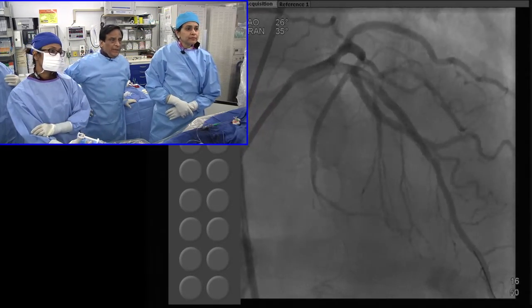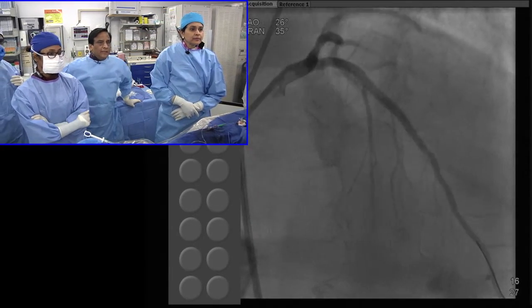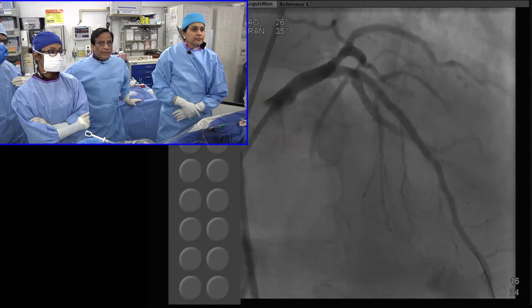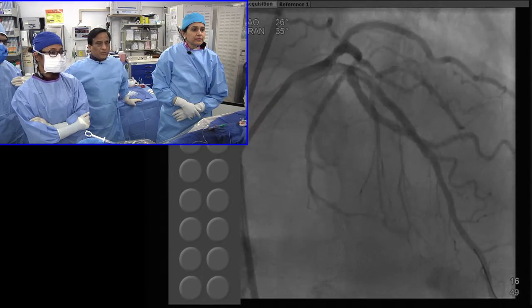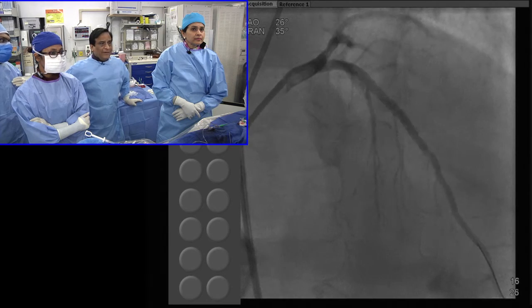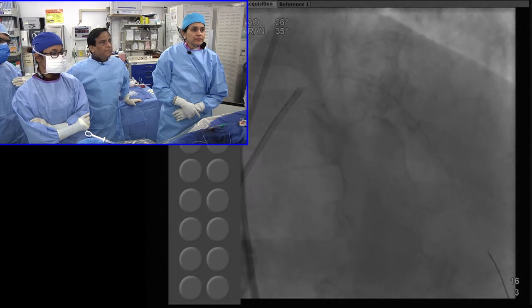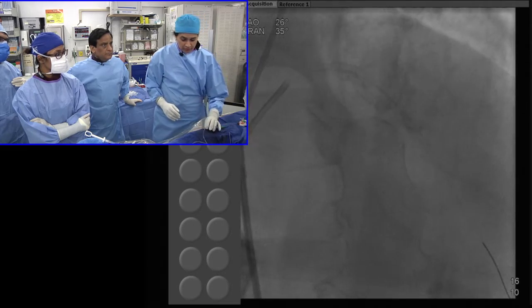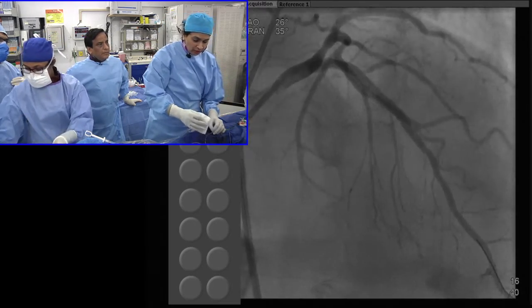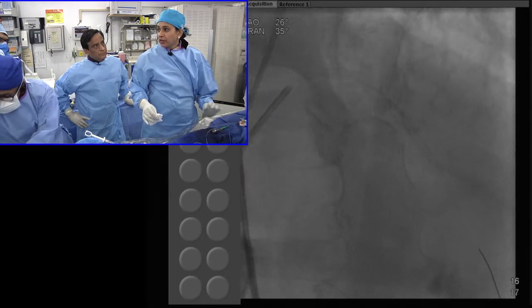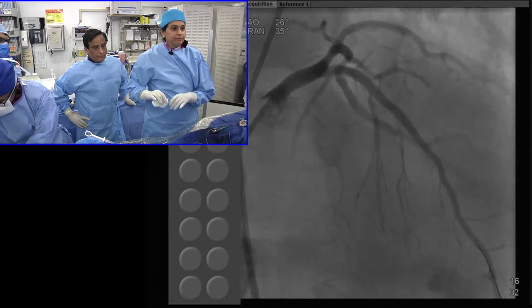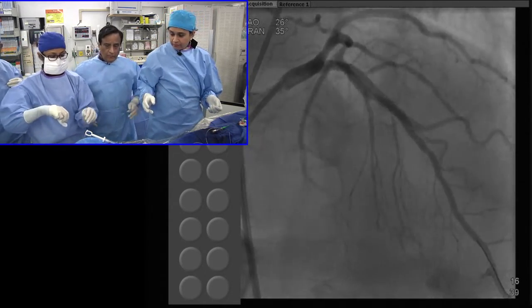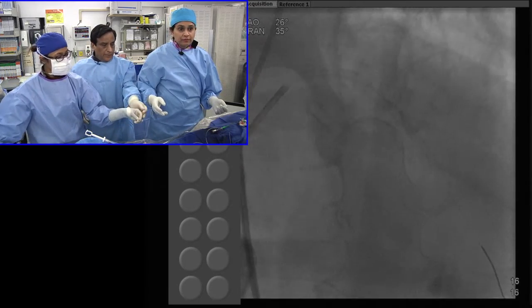Patient does have chest pain and now we can see that the ostium of the side branch is clearly involved. You don't even have to do FFR — the reason is because you have slow flow in the vessel. We agree — either way, are you planning to put a wire down the diagonal? Yes, right now we have to because the patient also has chest pain.